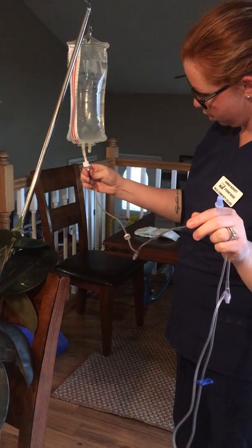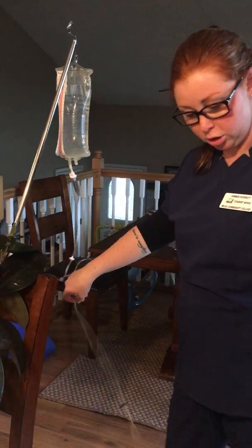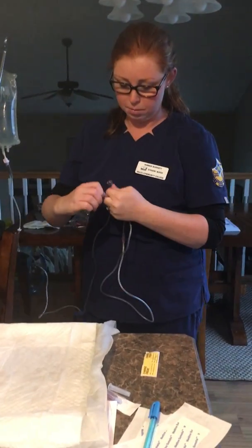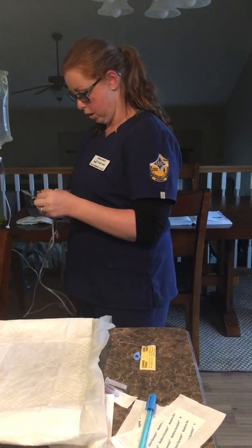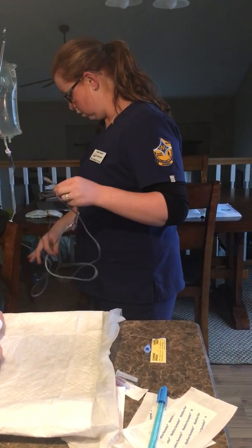About halfway. Okay. I want to make sure there's no air in my tubing, so I'm going to go ahead and just uncap the end, again maintaining sterility, and I'm going to go ahead and unclamp.